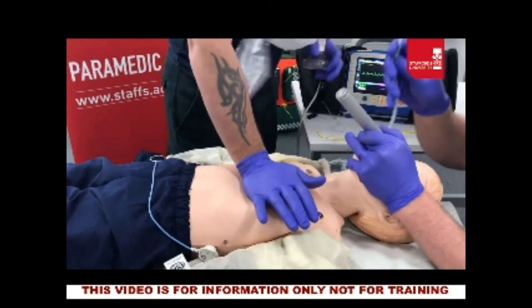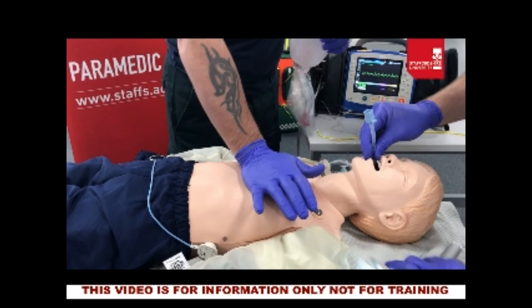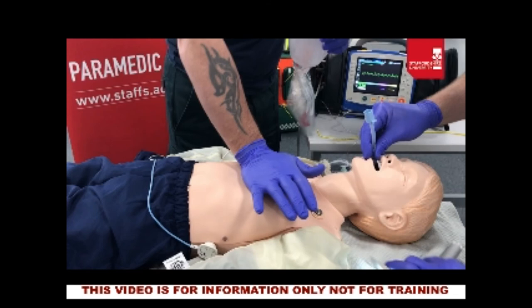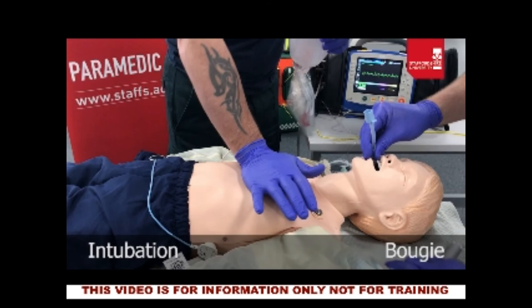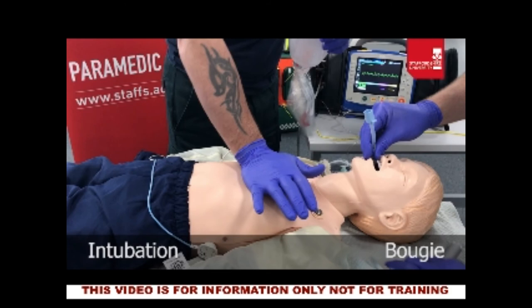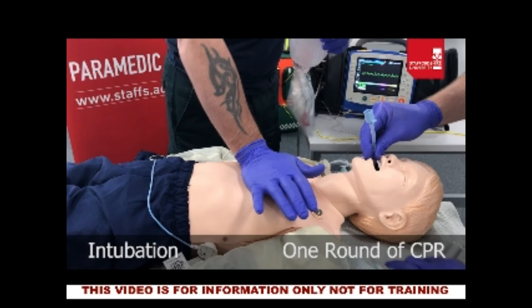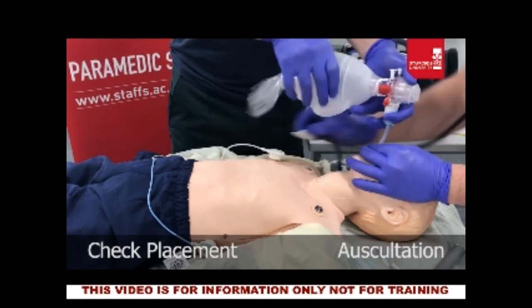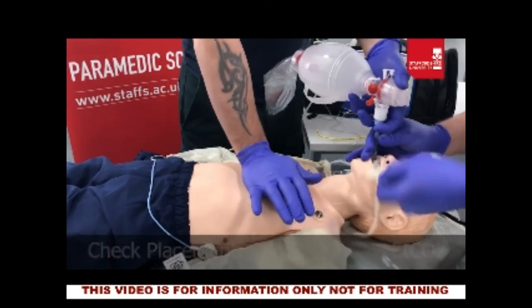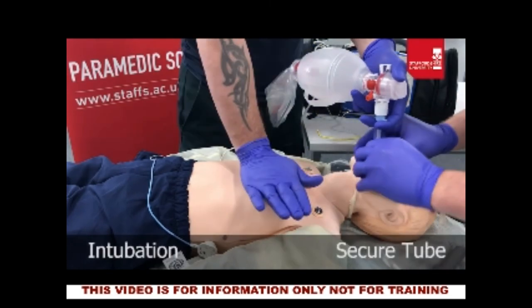The OPA is removed, laryngoscope is inserted, and the ET tube is inserted under direct vision. For this 7-year-old patient we are looking at a size 6 tube as per JR Calc. Depending on the tube size you may have a cuff to inflate or not — on this occasion there is no cuff on this tube. We have elected not to use a bougie on this occasion, however dependent on local guidelines you may be required to, and Resuscitation Council guidelines state that one must be available. All of this needs to take place within one round of CPR — with practice this should be achievable. We check tube placement by looking for equal rise and fall of the chest and auscultating both sides of the chest and over the epigastric region. We also connect waveform capnography, aiming for no longer than 5 seconds off the chest at any point. Once placement is verified, we secure the tube using the tie, reinsert the OPA as a bite block, and attach a catheter mount to take pressure off the tube.